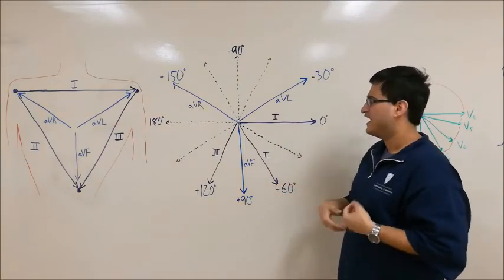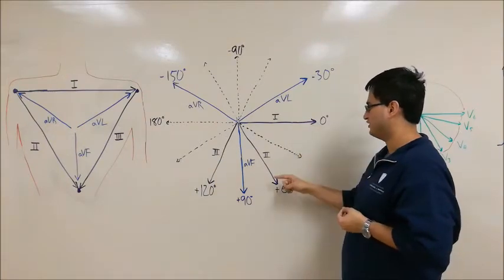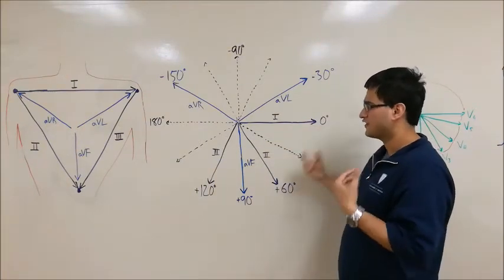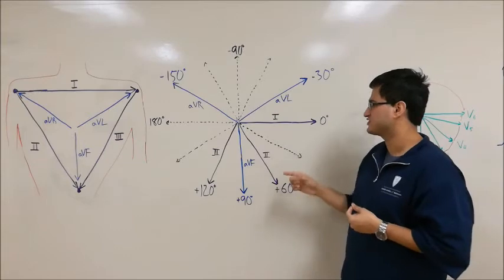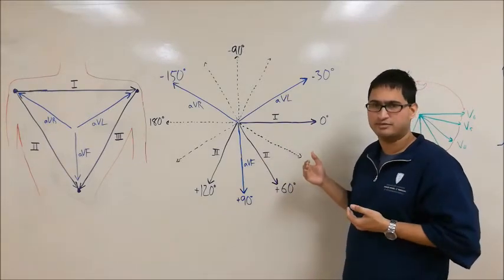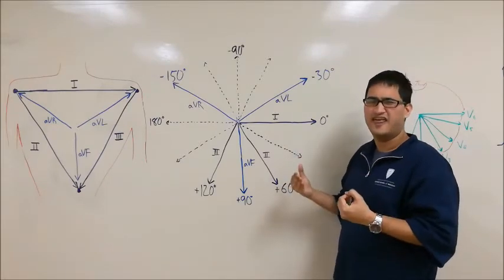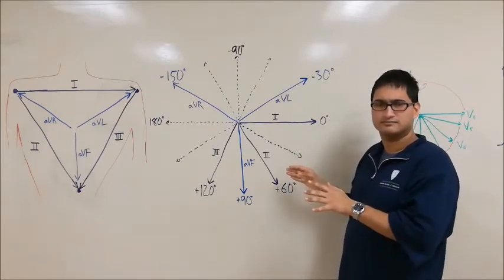For example, if the activity of the heart is going in this direction, lead 1 or 2 are not directly in this direction here. Rather, we have to look at the component of that vector directly in the direction of leads 1 or 2, or this is an arbitrary example, in order to actually measure the electrical activity. And we're going to do an example right now.